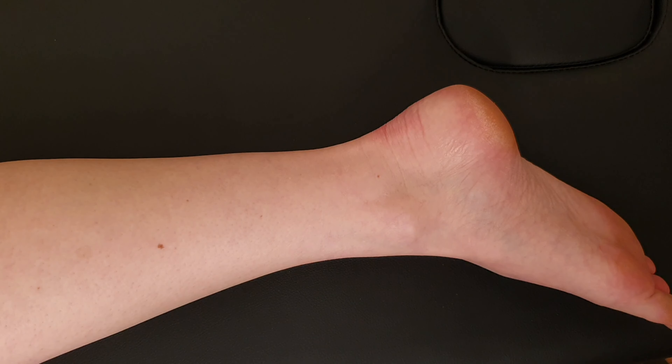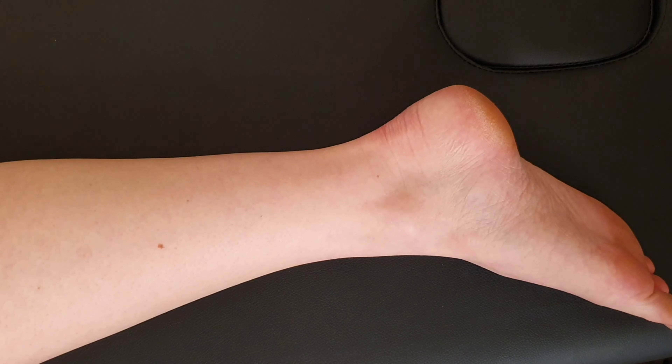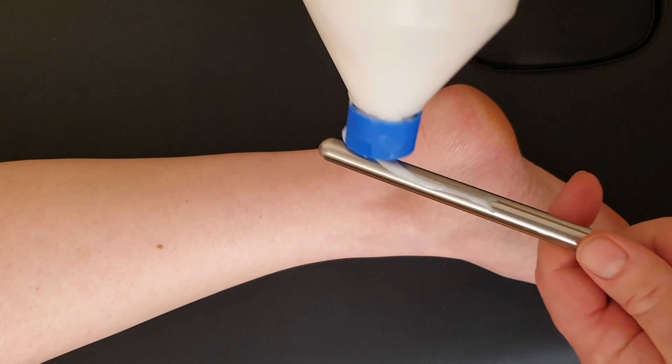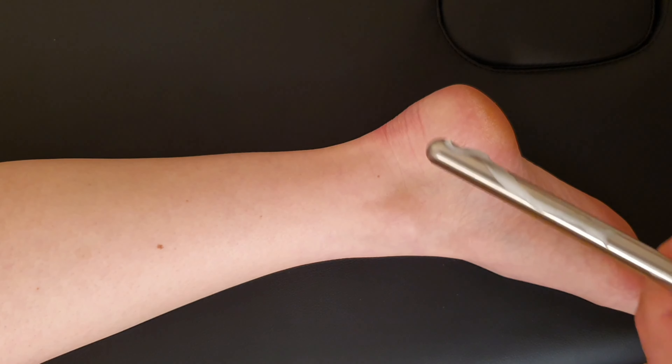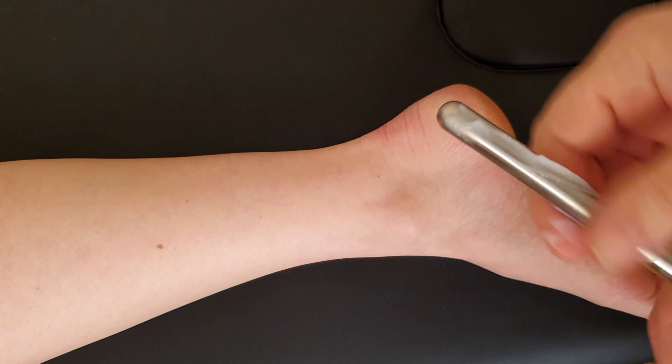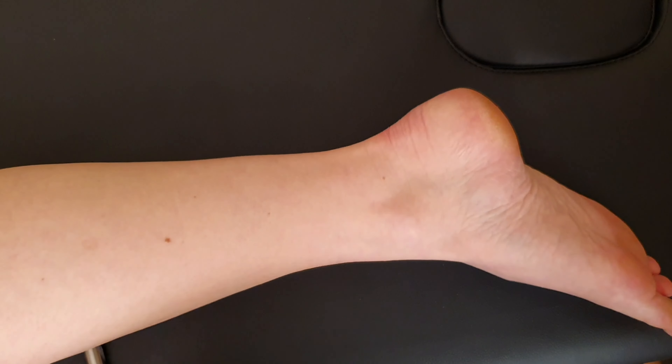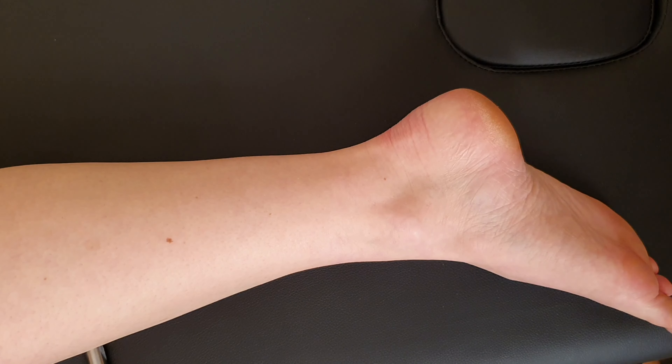We need an earthing electrode, so we bring that in here and just place it underneath the patient — underneath a fleshy bit. I don't like to put the earthing electrode underneath a bony part. As you can see, the foot is particularly bony and the shin is particularly bony, so I'm going to go for the calf. It doesn't really matter as long as it's in good contact with the patient. You could even let the patient hold the earthing electrode in the hand and it would still work.